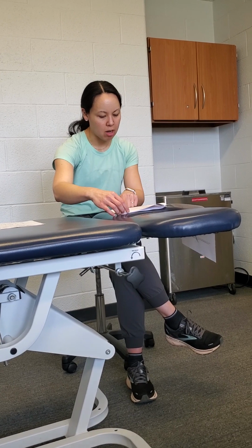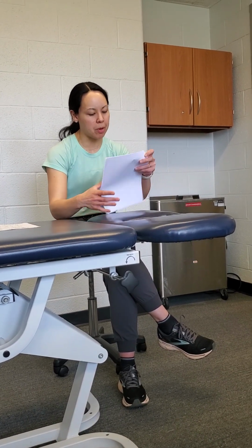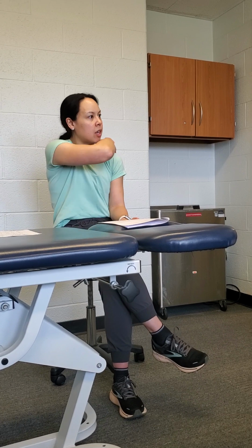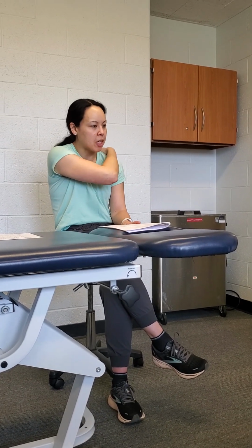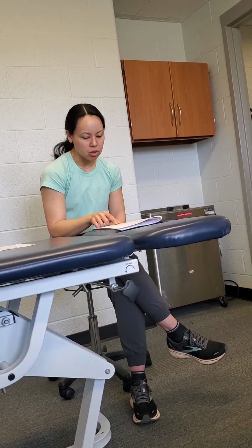Yeah, and then again, it's just talking about the mechanisms. This is probably good to talk about: the proximal effects. For example, if you're working with someone, let's take the shoulder, recovering from rotator cuff surgery. They've got a lot of atrophy back here, but we're putting the cuff distal to that. Studies have shown there's a proximal effect. So even though the cuff is below the targeted muscle group, they're still going to gain strength, which I thought was kind of interesting too.